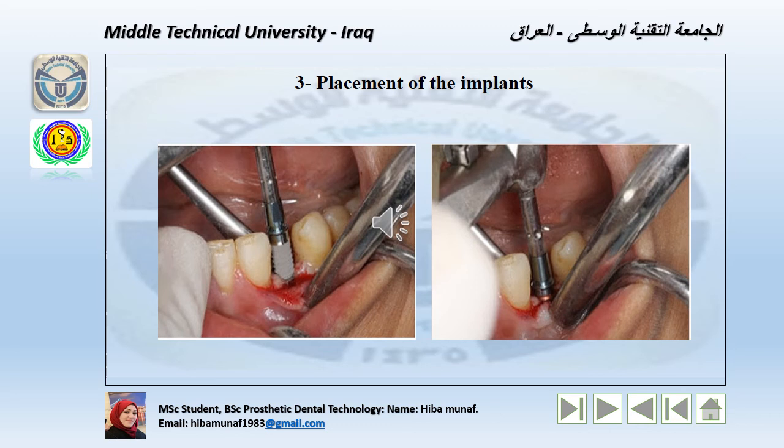After finishing soft tissue reflection and drilling, now comes placement of the implant. The implant is screwed into place with a precise torque so as not to overload the surrounding bone, which may cause osteonecrosis or failure of the implant. A specific screw key is utilized for the operation.